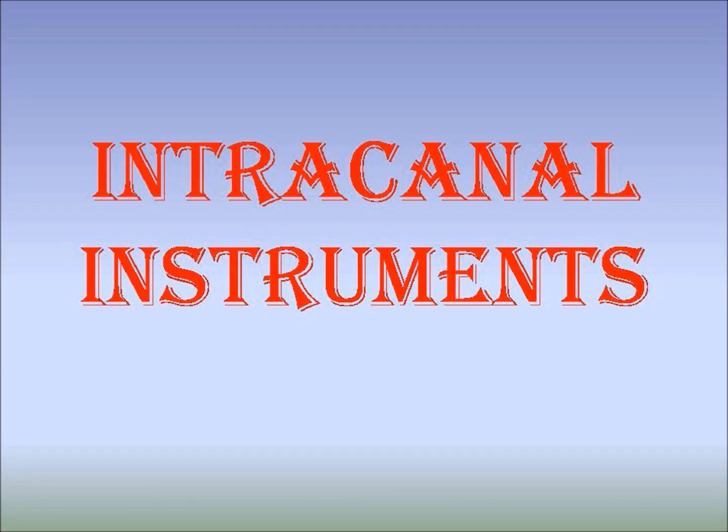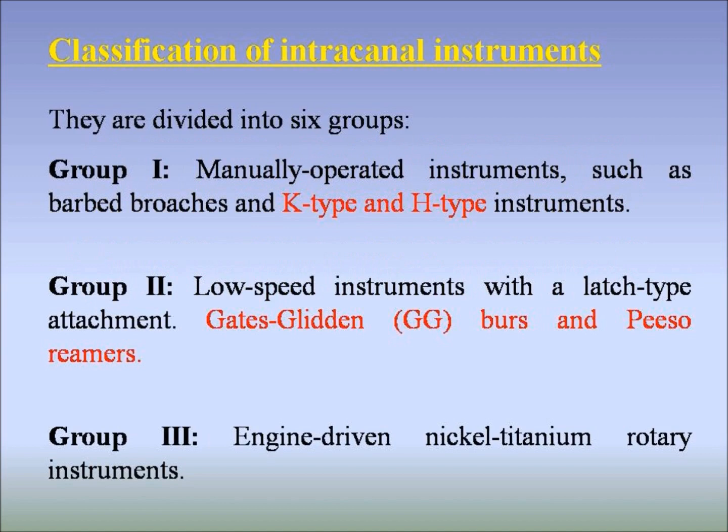Intracanal instruments. Classification of intracanal instruments. They are divided into six groups.